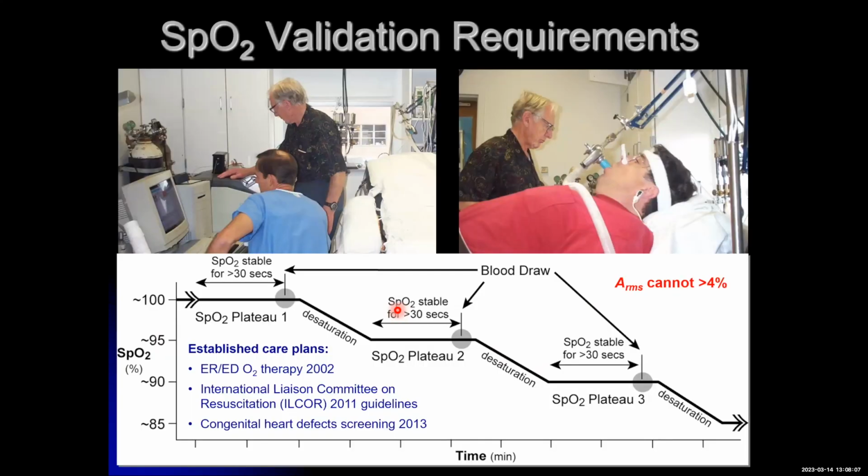All right, so this is a very meaningful data point for me when it comes to doing desaturation studies. This is Phil Bigler here. I'll try to circle him a little better right there. And this is Dr. Severinghaus, and they ran out of medical students on that day, so that's me on the table.